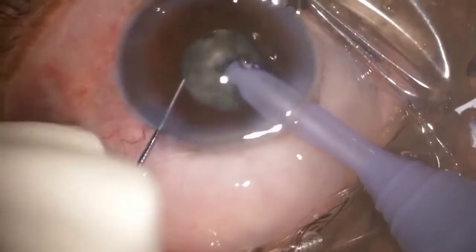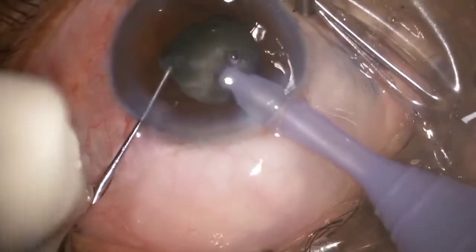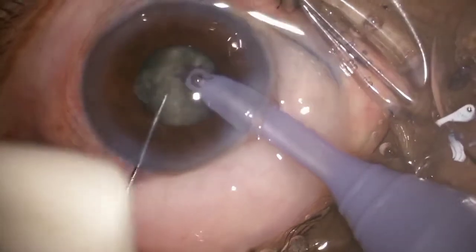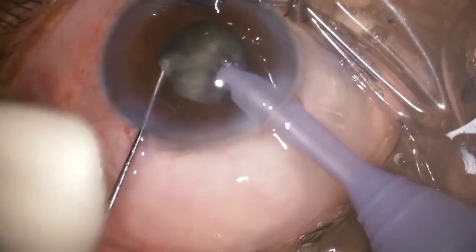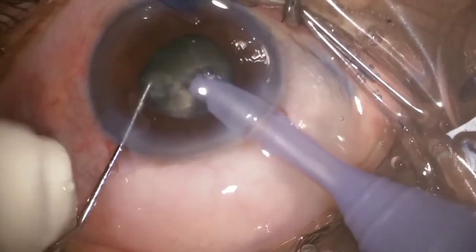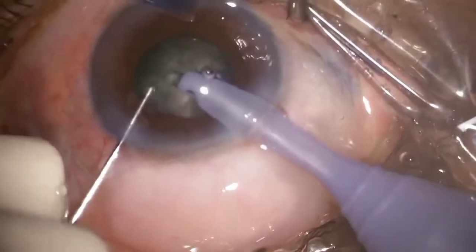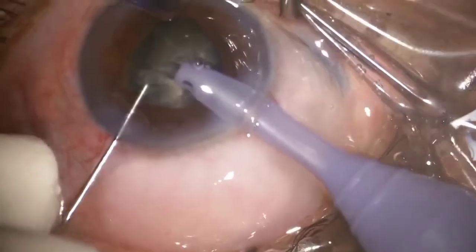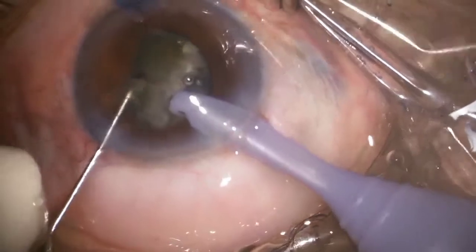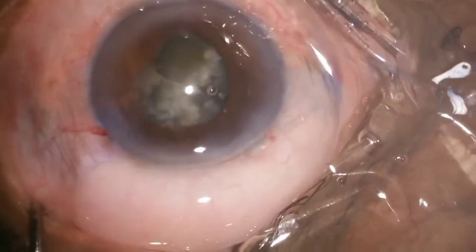So what I did, I lifted the nucleus on one side and decided to do the cracking of the nucleus in the AC. But it was getting a little difficult because, as you can see, my power was very less. Also in phaco chop mode, my power was around 40 and vacuum was around 310.